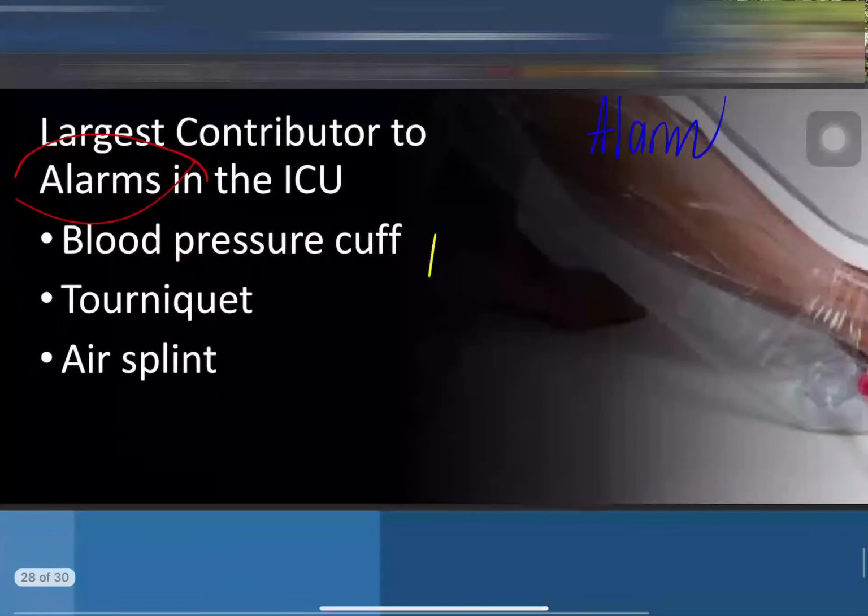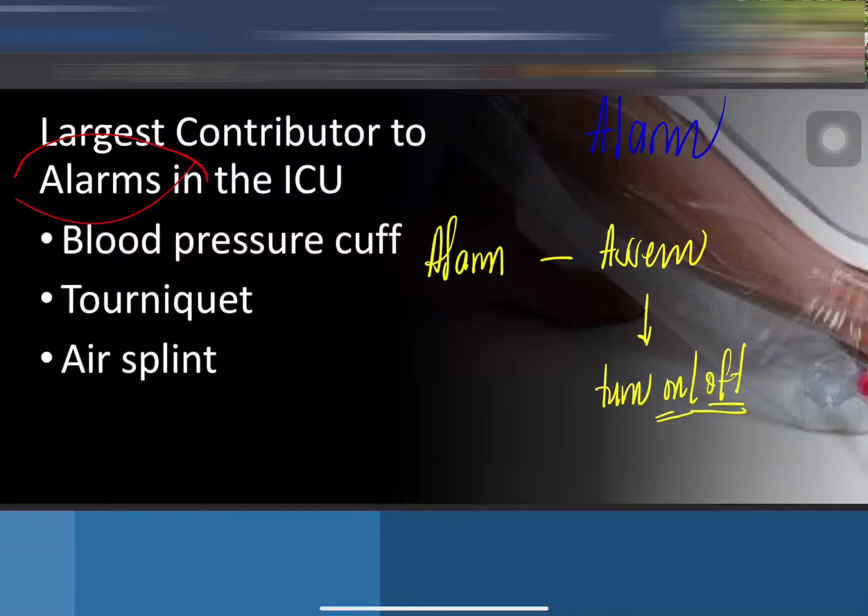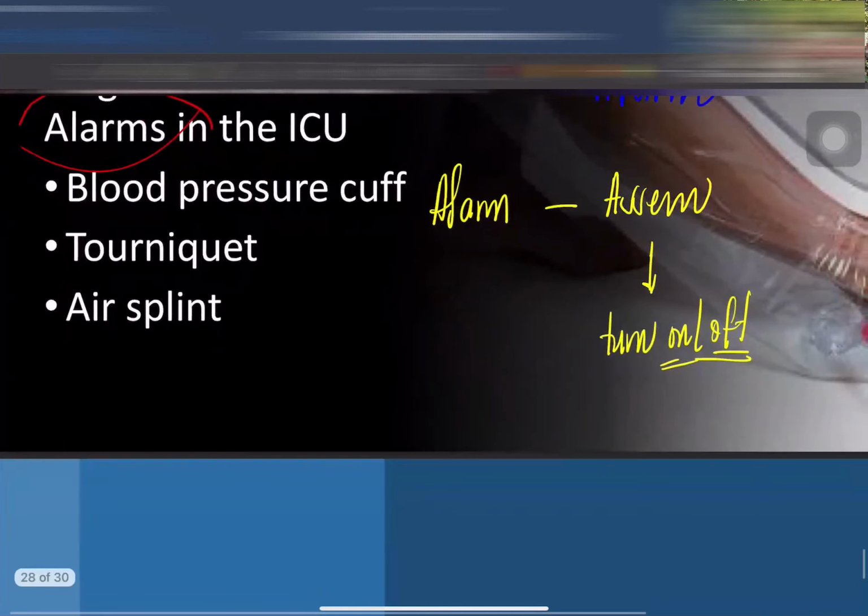Class, I told you, when we hear an alarm, the next best step is to assess your patient first before you decide what to do with the alarm, whether it stays on or off. Because, class, alarms were made for a reason. We have alarms because they are needed. But there's a very big but again.